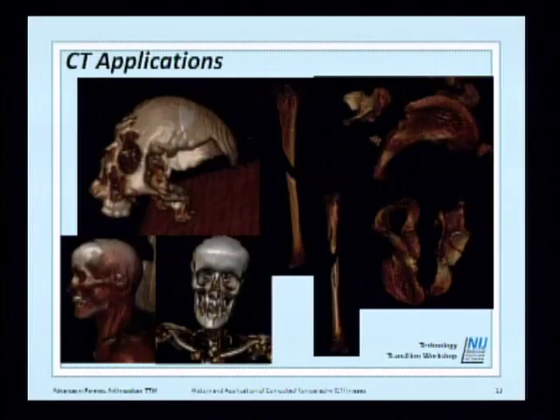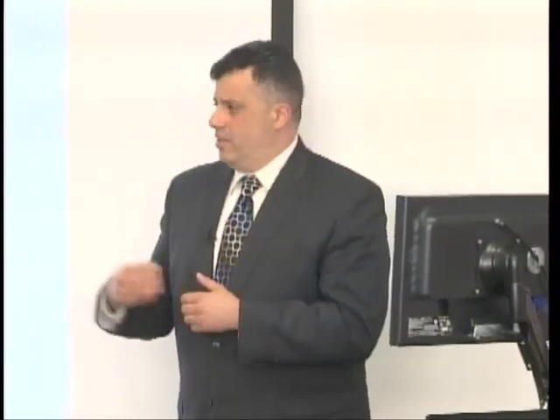And to be clear here, visualization is a very important part of the CT applications. Some of this is showing a volume rendering visualization, and this is done routinely if you are doing scans and you look at the workstation of the CT machine. Some of these are volume rendering with some transfer function to look at specifically bone or soft tissue. In our cases, sometimes we do segmentation and then compare it with volume rendering to see how good the segmentation quality is.